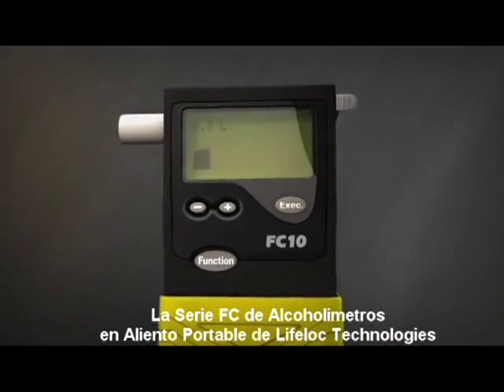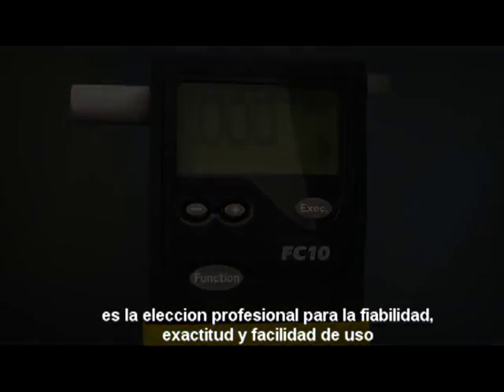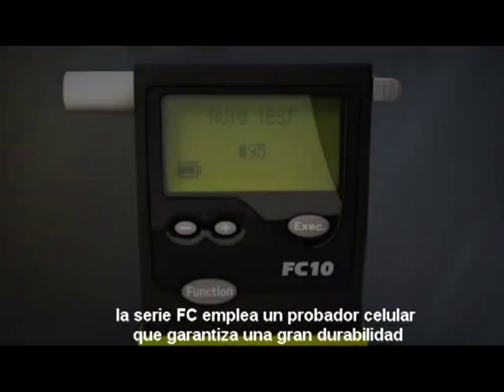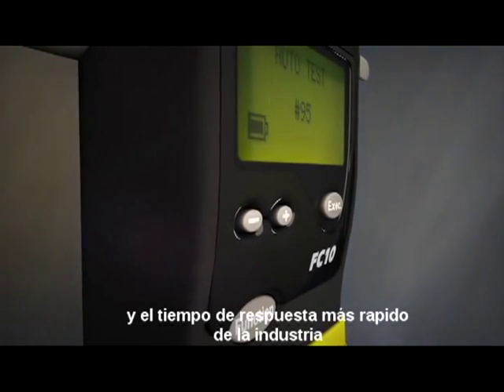The FC Series of Portable Breath Alcohol Testers from LifeLock Technologies is the professional's choice for accuracy, reliability, and ease of use. The FC Series of Platinum Fuel Cell Testers offers long working life, unsurpassed test accuracy, and the fastest response time in the industry.